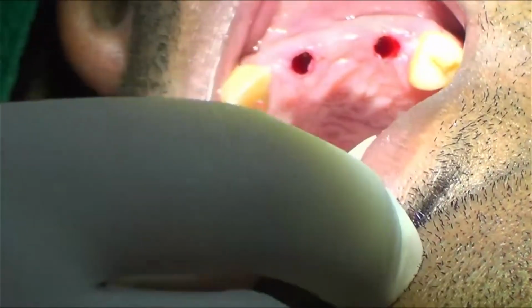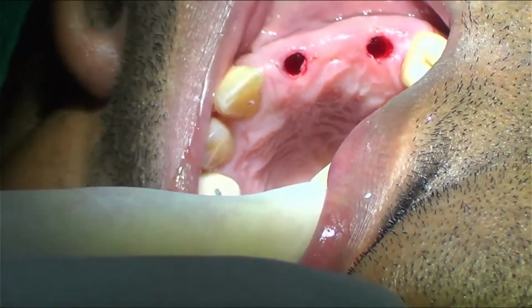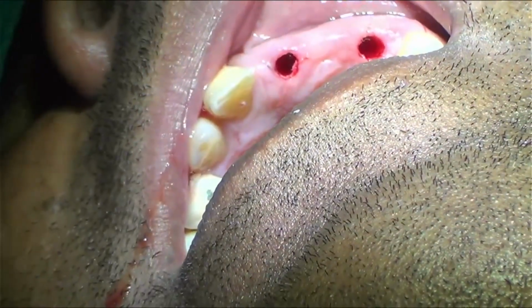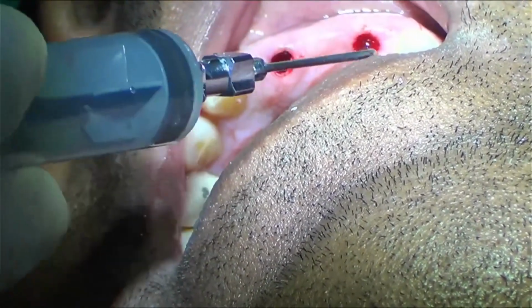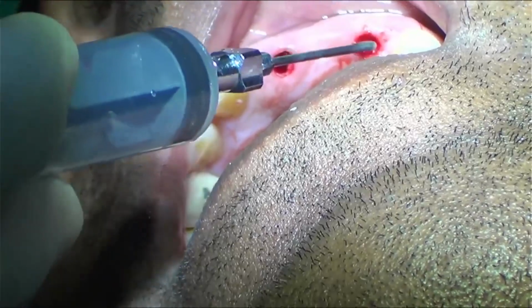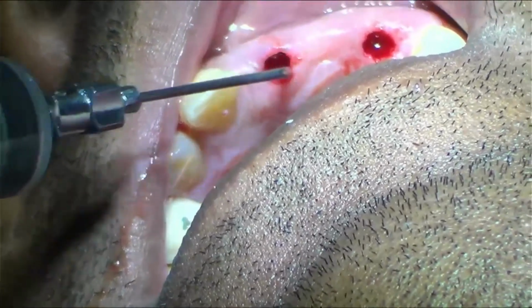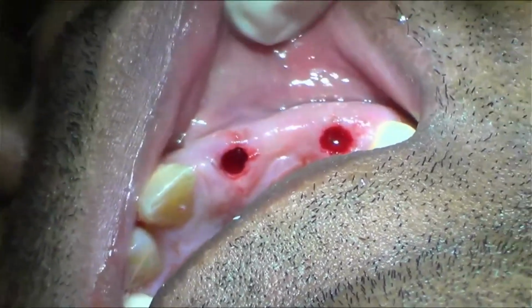So you can see this? 2 small holes. Okay, and the osteotomy is prepared. Now what we have to do is just place the implant. You can take a post-operative CBCT of this patient. We'll evaluate. So you can see I can feel my bone on all the sides. Okay, the bone is adequate on all the sides. So it is as per my plan.